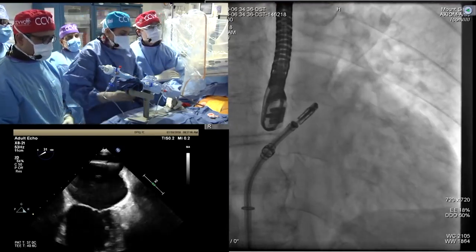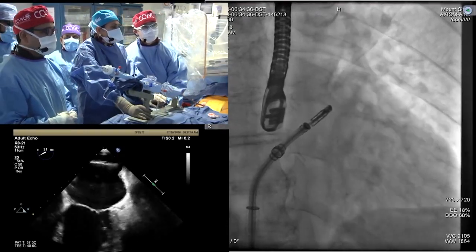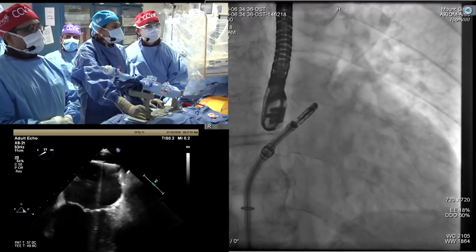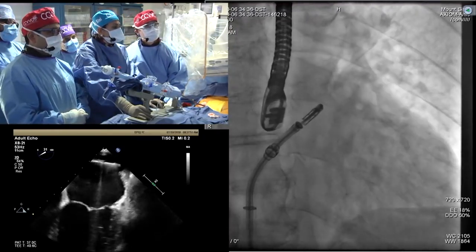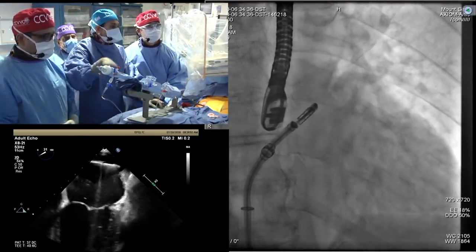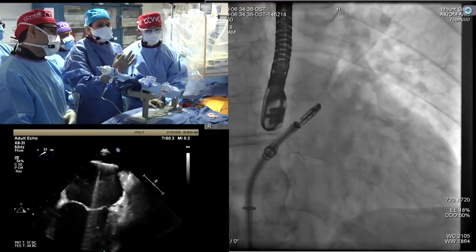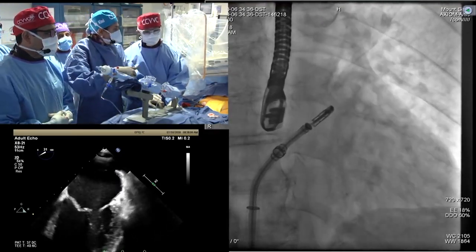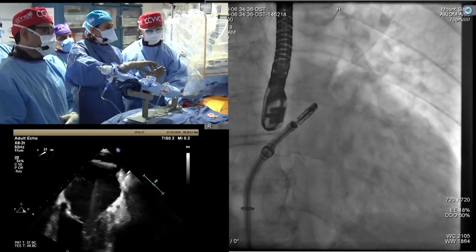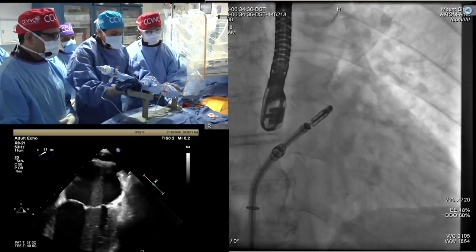So next what we will do is the movement, which should be posterior, and then medial. Why posterior? Essentially, the posterior leaflet forms about two-thirds of the annular attachment of the whole mitral valve, and the line of coaptation, which we call the smiley face on the echo, is posterior. That is why you go medial, because that is how the mitral valve is facing, and then you go posterior. That's the movement we are going to do now.